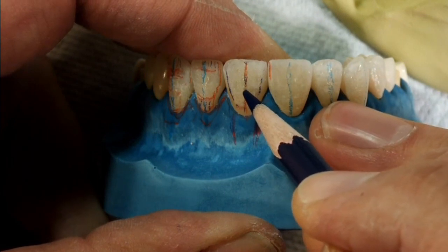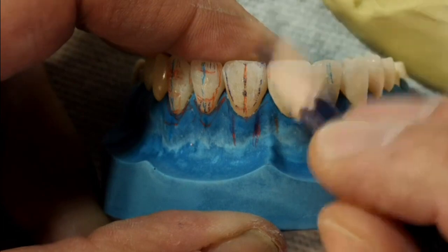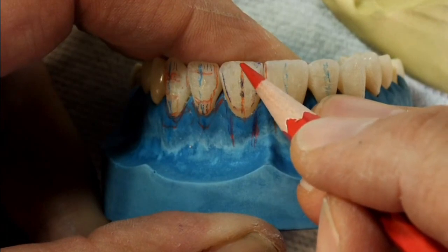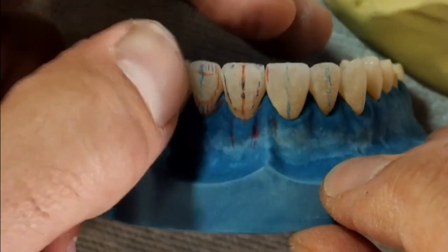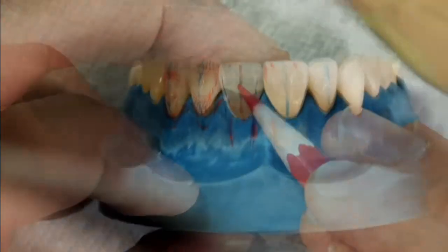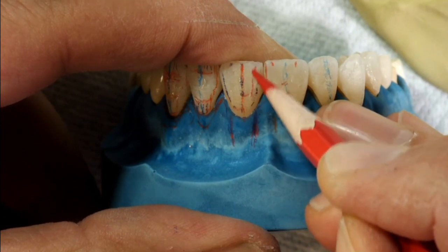The third point is at the mesial incisal corner, slightly distal of the line angle. The fourth point is along the long axis about one millimeter above point two. The fifth point is more toward the distal side of the long axis — it depends on the tooth shape and how much you'd like to emphasize the distal line angle. A good idea to create a mirror image of the primary plane is to turn the tooth around, hover it over the contralateral tooth, mark the point at the incisal edge, then transfer the points along the long axis to the contralateral tooth.